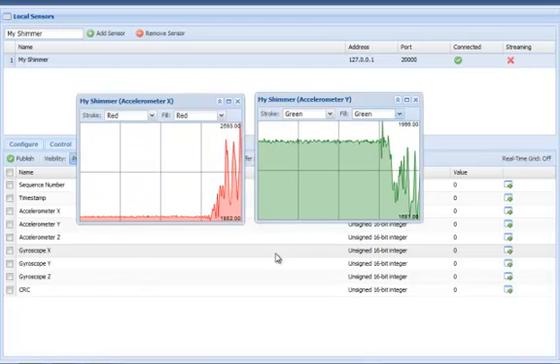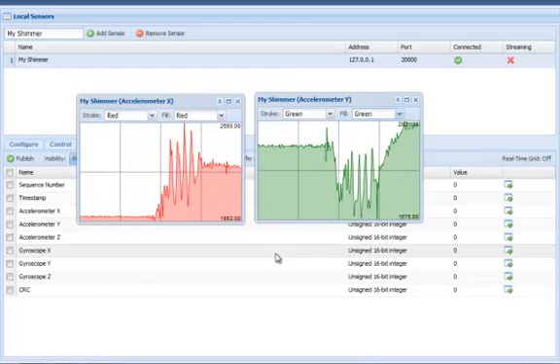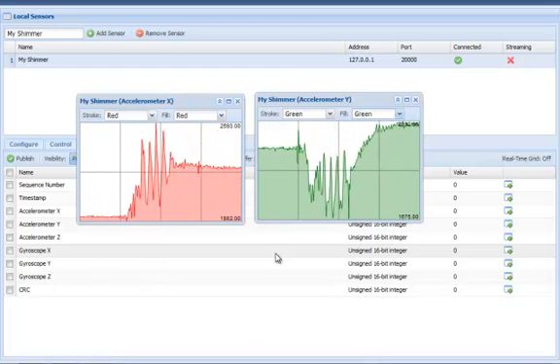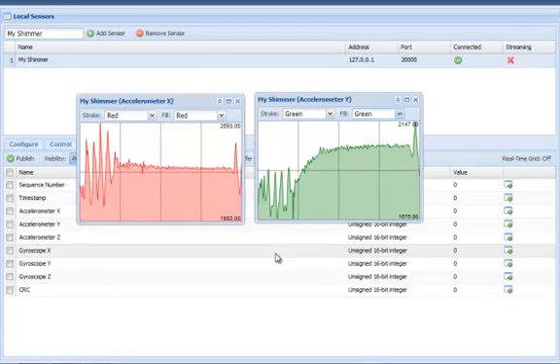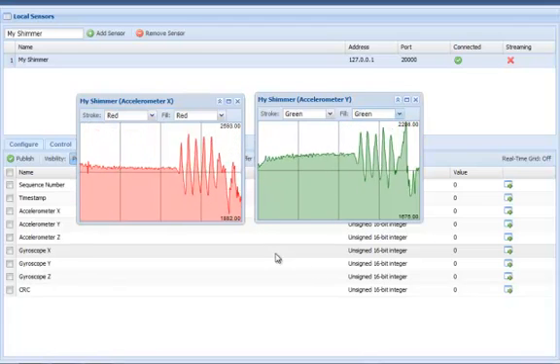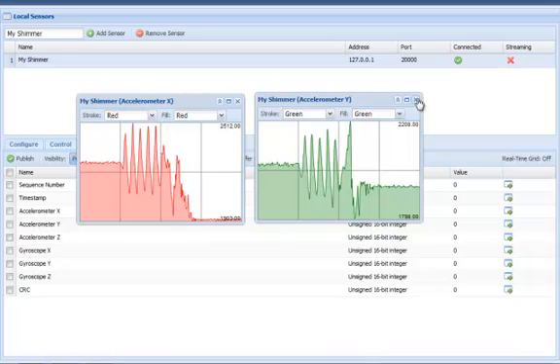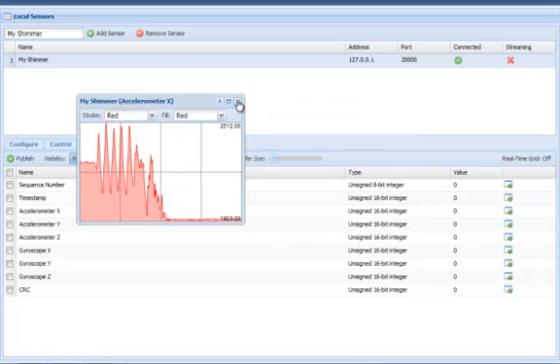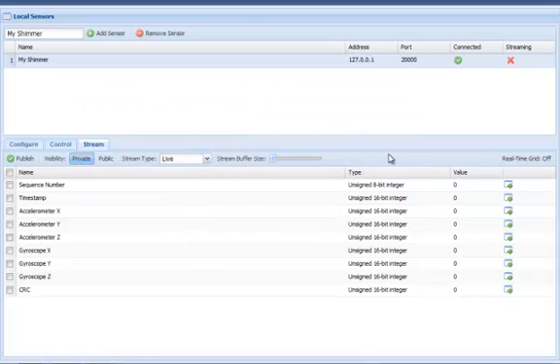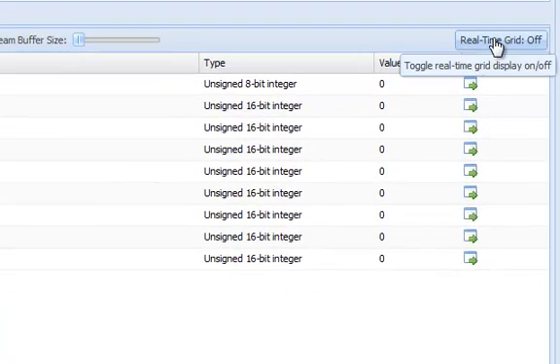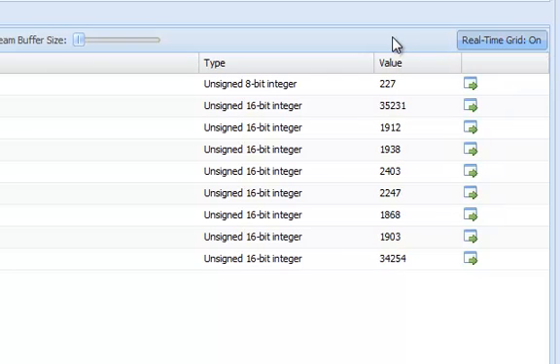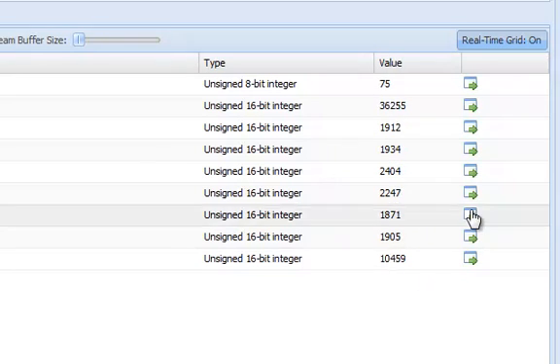Here, I am viewing the accelerometer data along the X and Y axes. I can also turn on the real-time grid to get live updates as the data is parsed from the Shimmer.